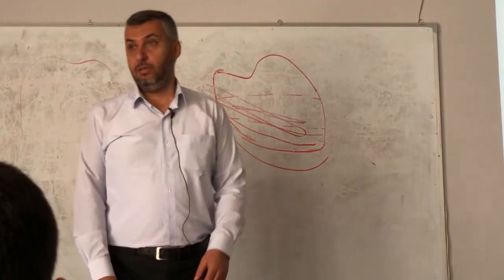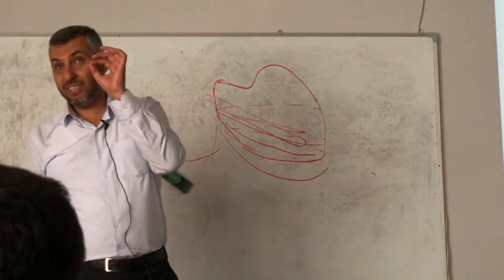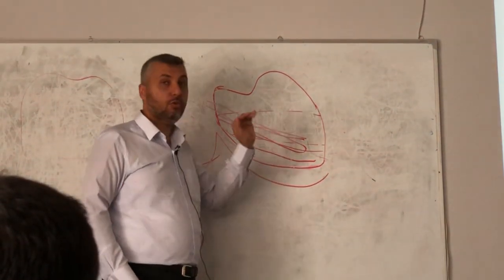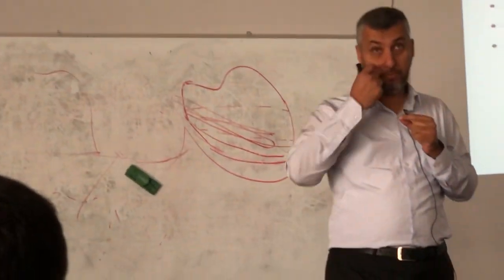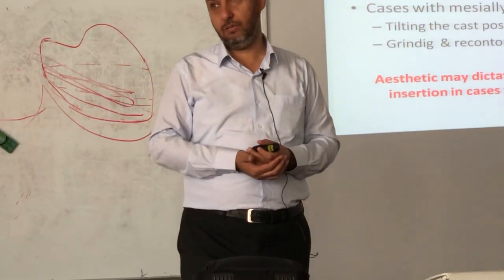We still can do recontouring of the tooth. If it requires minimum change or alteration, you do recontouring. In the last lecture we covered recontouring of the tooth, changing the position of the survey line.